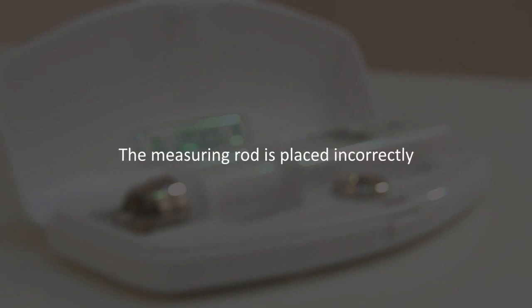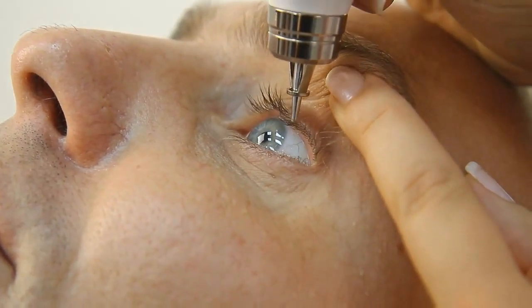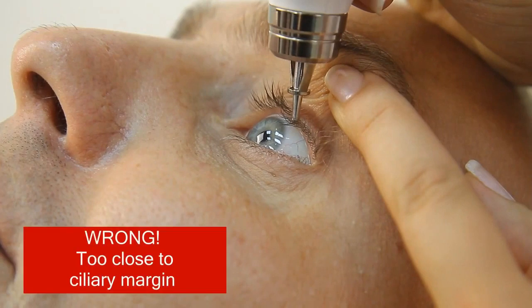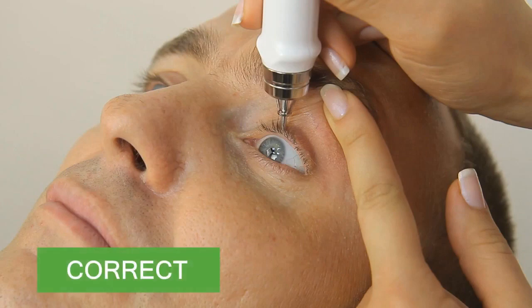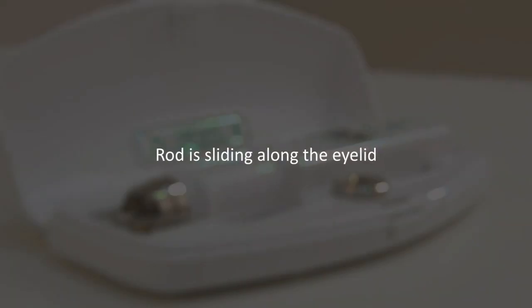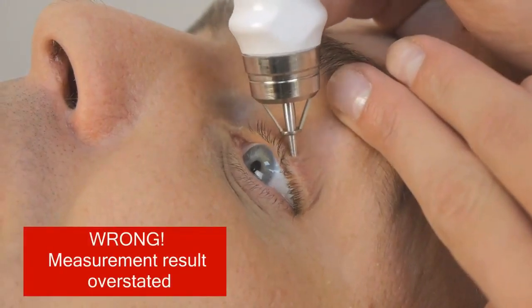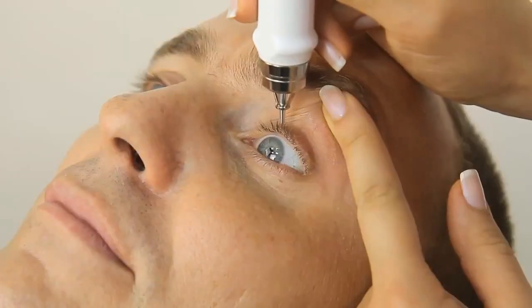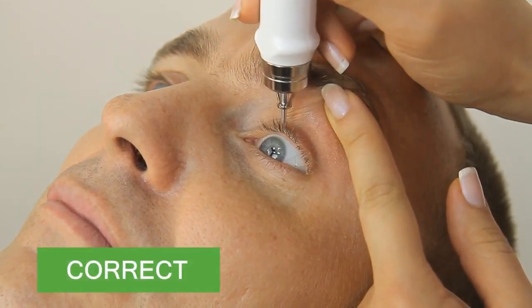The measuring rod is placed incorrectly. The tonometer rod should not be too close to the ciliary margin or too far apart from it. The rod is sliding along the eyelid — the rod must not slide along the eyelid during measurement. The tip of the rod should be fixed; the rod must move only up or down.